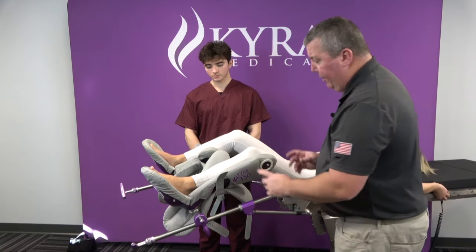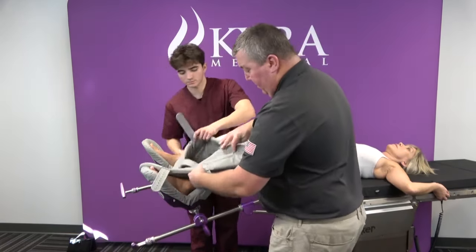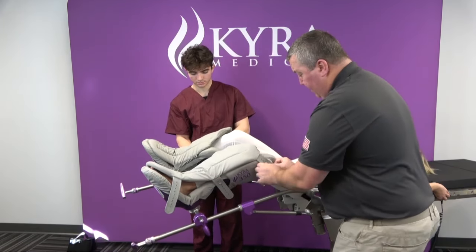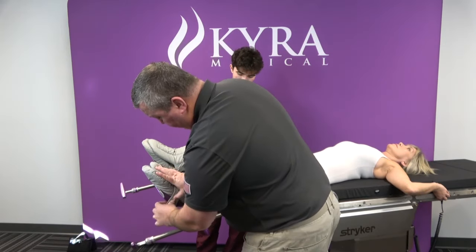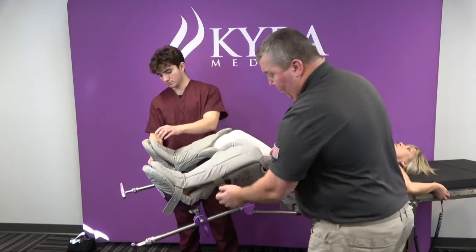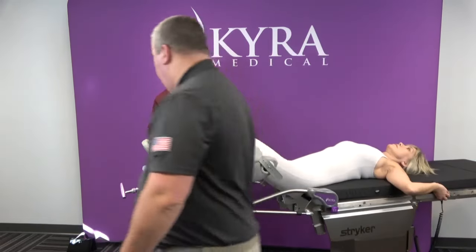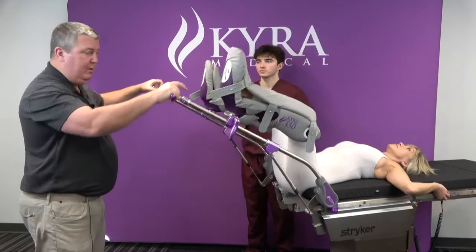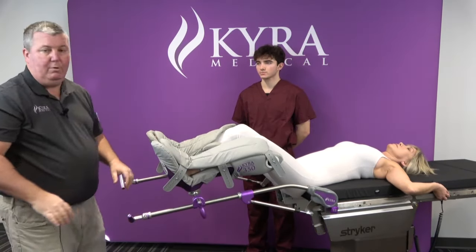Once we have all three things set, we take the top flap and turn that over, using the secure lock straps — no Velcro. We use all three straps, and you can hear the audible noise they make. You don't need to over-tighten these. We're locked in on both sides, and then I just turn into high lithotomy, low lithotomy, or whatever position you need for urogynecological procedures.